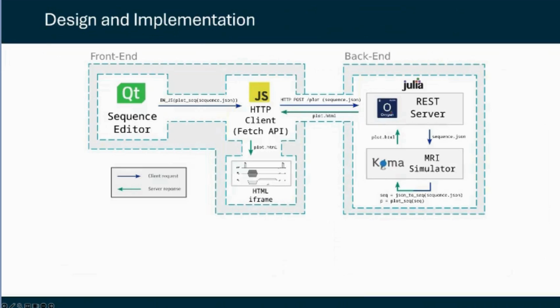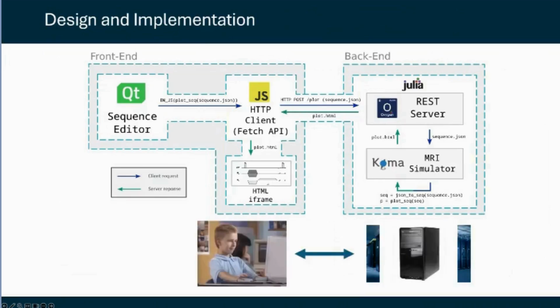The user experience might actually look like this. What happens is the user doesn't have to know which device is running behind the scenes.